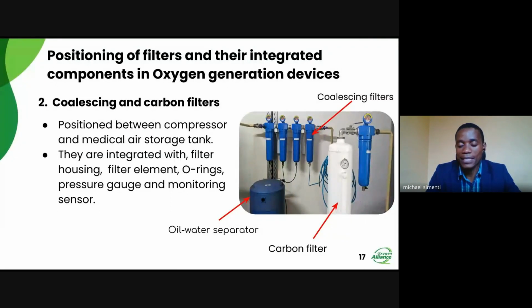The reason being is to just monitor the situation, the condition or the status of these filters. Are they in good condition or do they need to be maintained? So all that information is actually displayed on the PLC to those who use the PSA plants. They know there is a PLC.